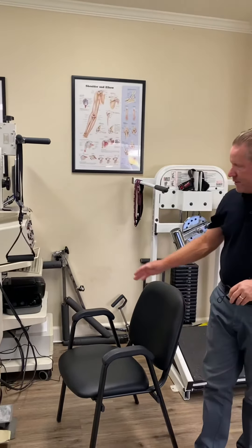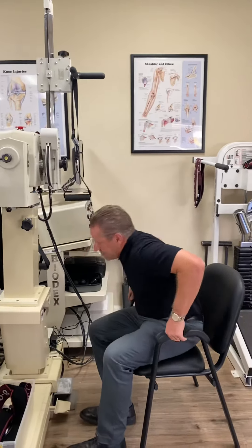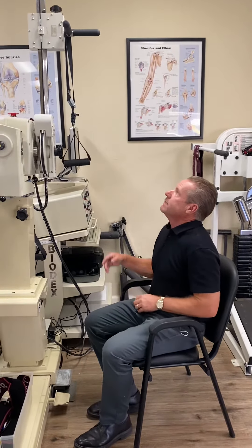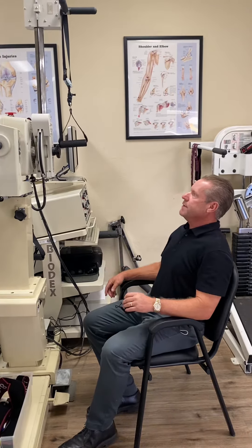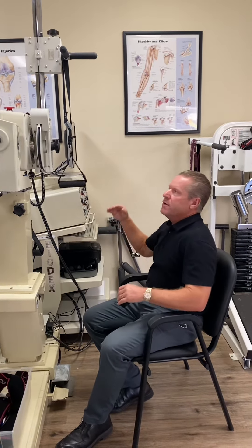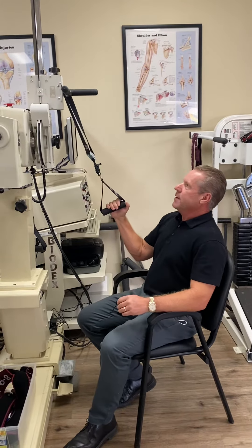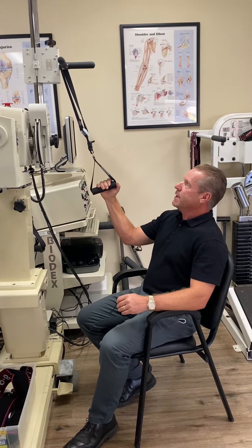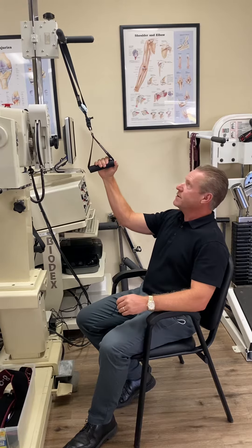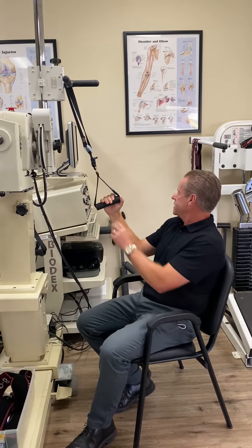Sabrina had a good idea — we could use this as a sit-down station as well. So you have the person seated, you've established the range of motion that you feel is appropriate. You want to do less range of motion first, so I'm here. Let it cycle — notice I just turned it down to about 60%.